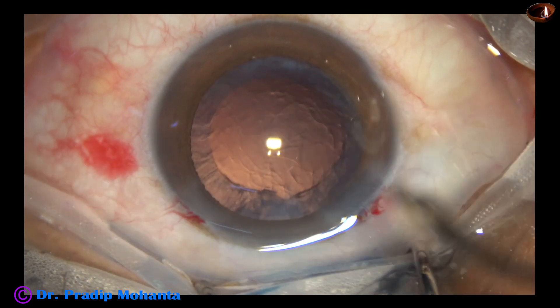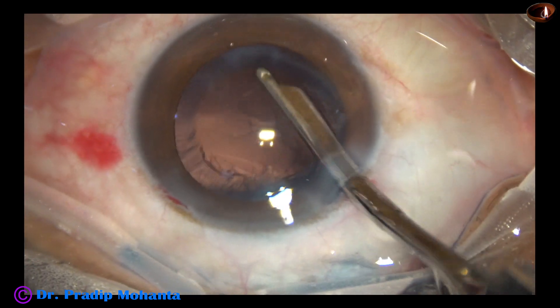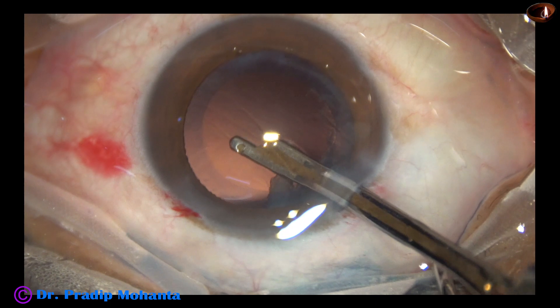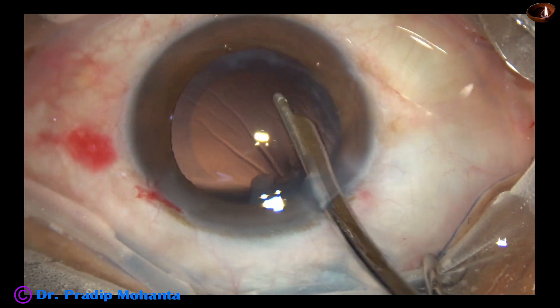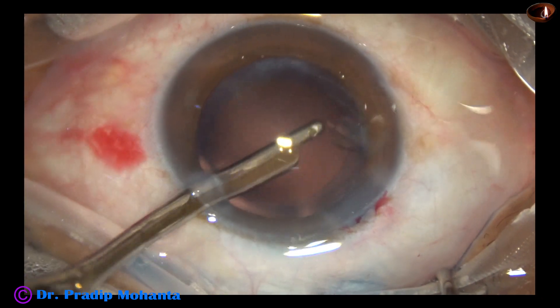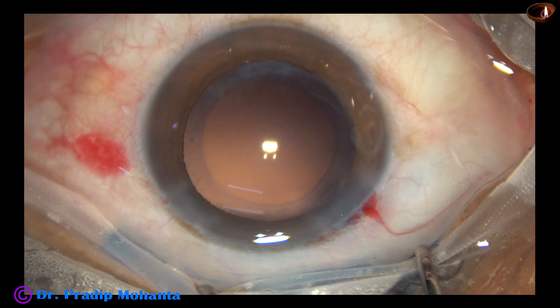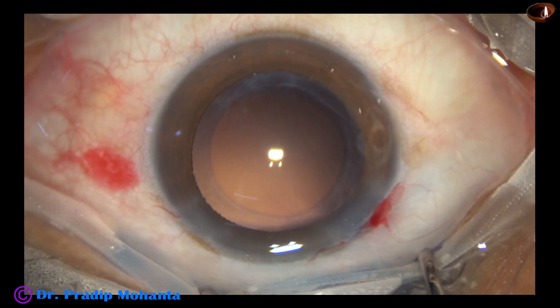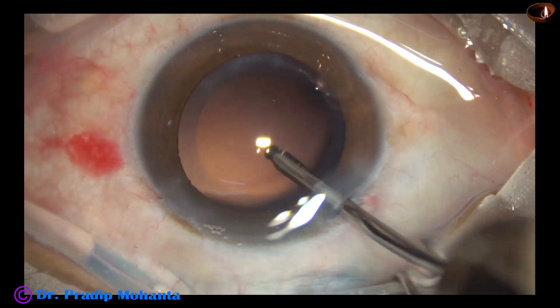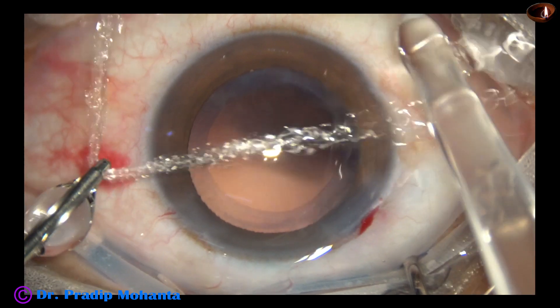I am going to use a 23-gauge Simcoe cannula for removal of this cortex. The cortex is coming very easily. To remove the sub-incisional cortex, I go through the side port. The side port is a little large — it is about 1.8 millimeters, and the main incision is 2.8 millimeters. So the astigmatism produced by the main wound has been reduced to some extent by the side port, because the side port is placed 90 degrees away from the main wound.